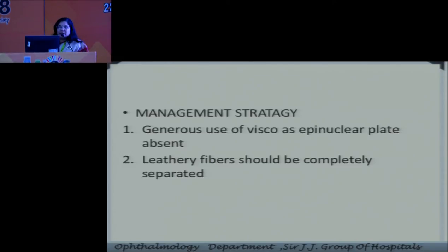If the first division is complete and very good, you are halfway home. So that is very, very important. First division may take a little bit of time. If where you are trenching and in front of you only half of it is cut, you have to rotate and then trench some more. So that is very, very important.